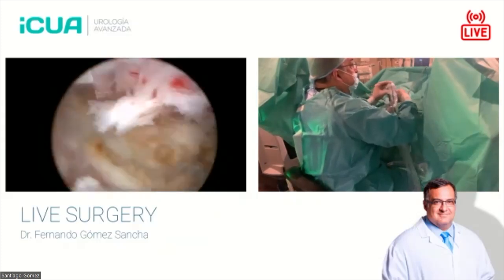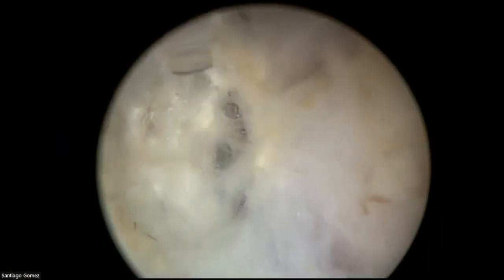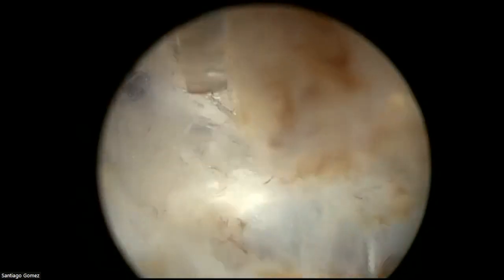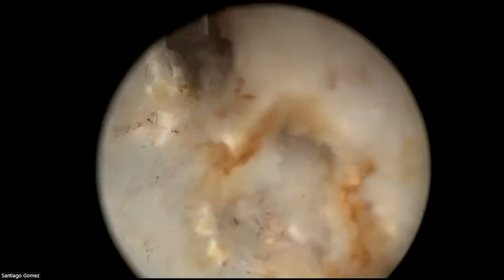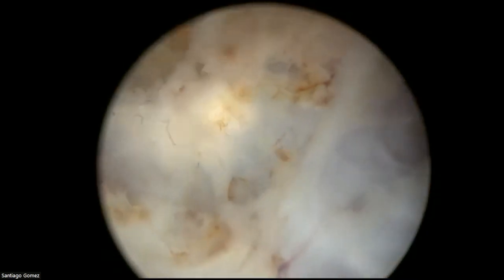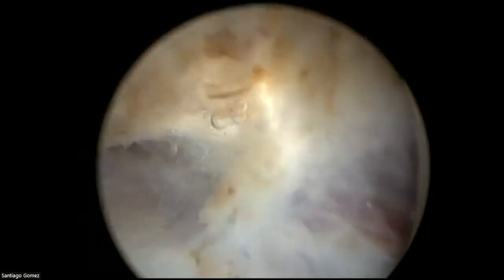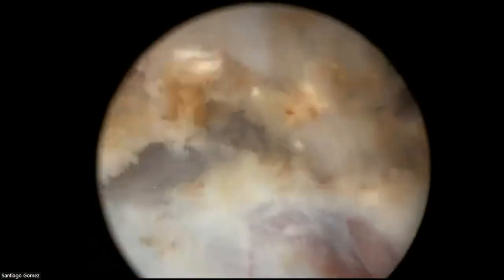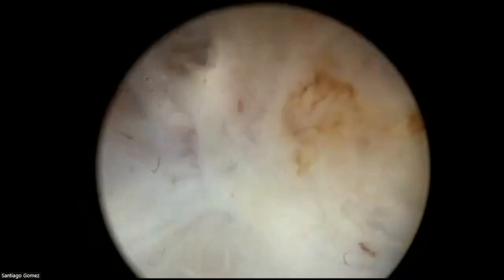Here, for example, it looks flimsy. I don't know if you can see the detail. I hope you can. But I'm taking a little bit more time in the dissection of this lower plane because I think there is some tissue worth removing here. Maybe a nodule. Sometimes this plane could be obliterated by inflammation, by a tumor, maybe the scarring effect of multiple biopsies. I'm trying to use the energy very softly, very carefully, so I don't deepen too much. Sometimes it's not easy because you are already working near a very thin plane, but I think this is adenoma. So we should take it out.